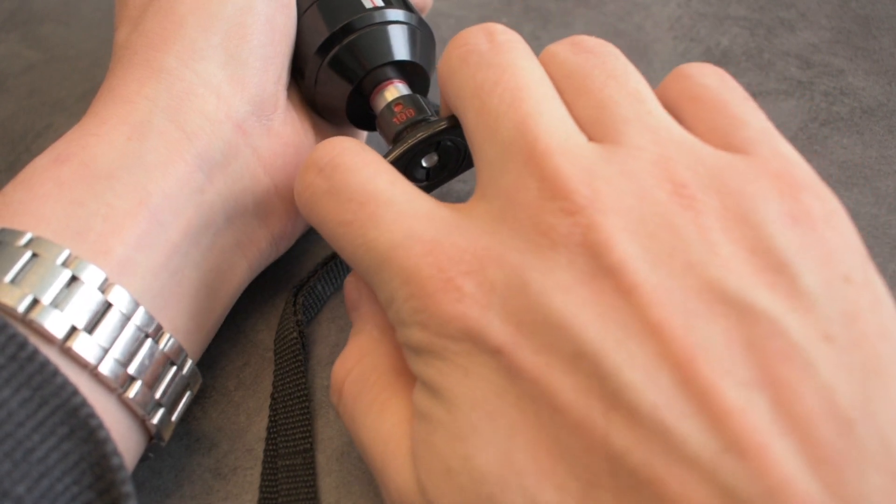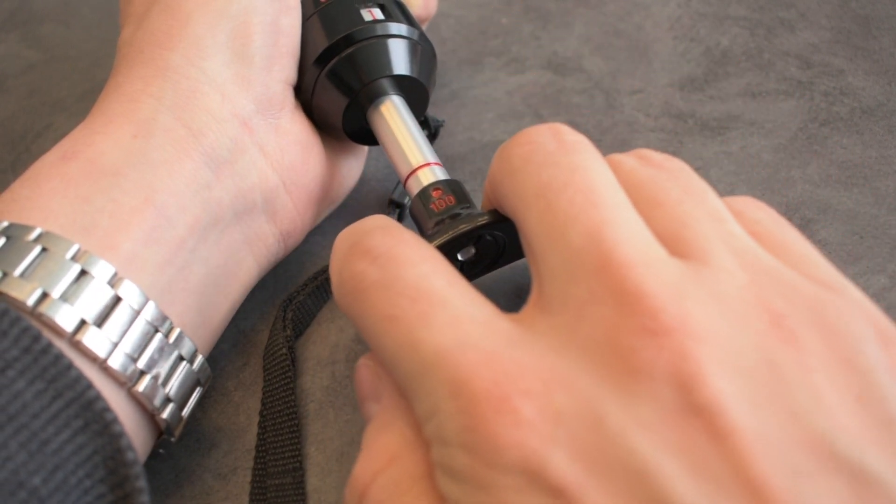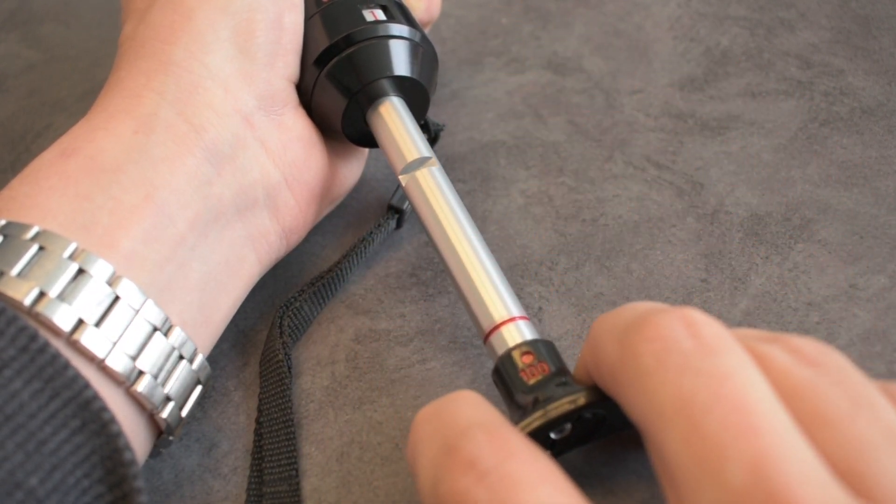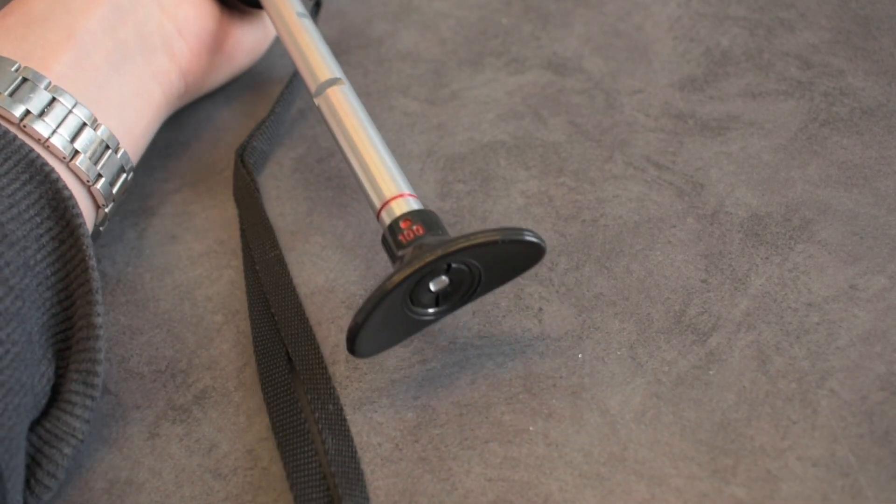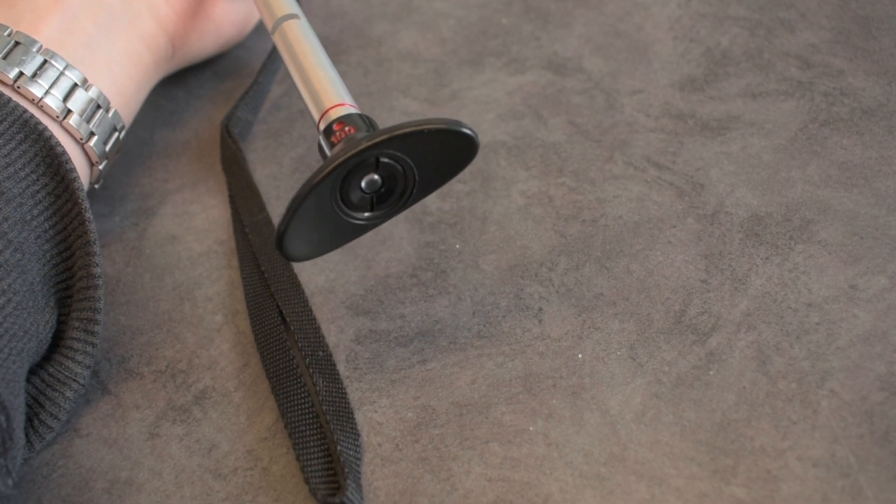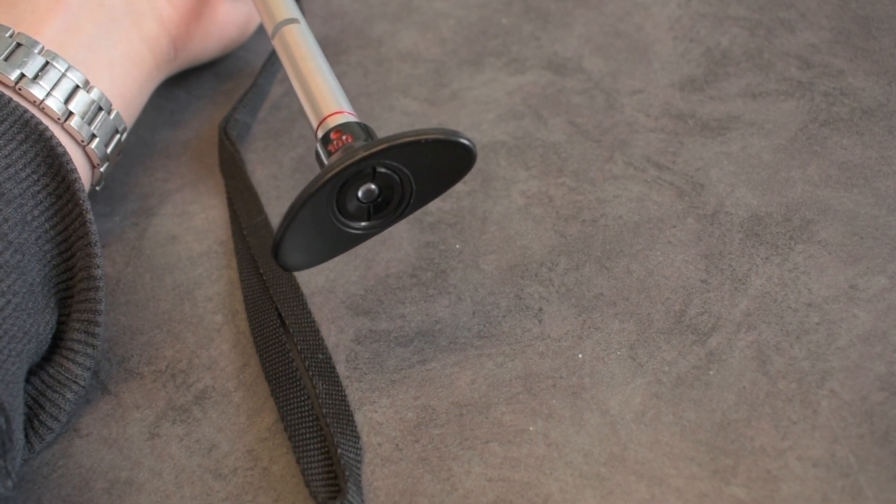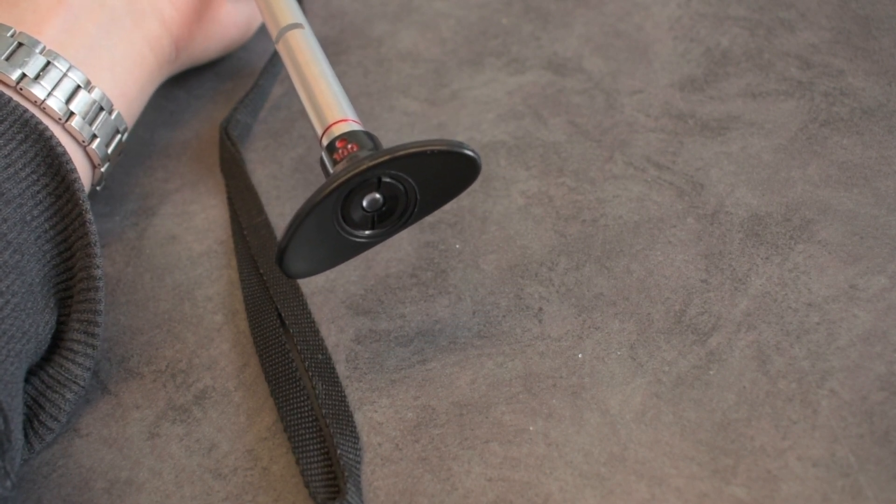Once we have it set to 100, grip the pump handle and give it a strong pull until the handle is fully extended. The handle should lock fully extended. If the handle is getting pulled back into the pump unit, you either didn't pull it far enough or you don't have those dots on the handle and the body lined up.